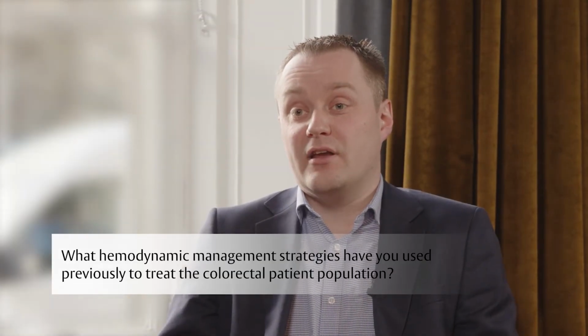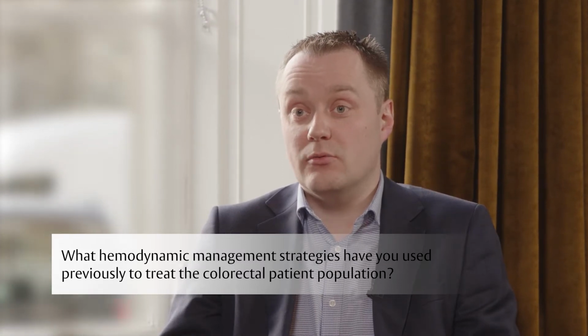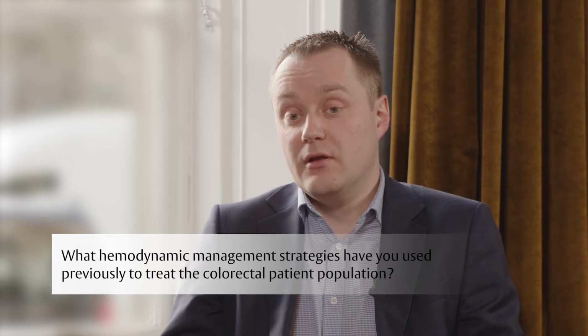So it'll be common practice to deliver anaesthesia for a patient undergoing colorectal anaesthesia and surgery for them to have an arterial cannula in place to have intra-arterial blood pressure monitoring. So we've got really quite invasive and accurate blood pressure measurement going on continuously for these operations, and that would allow you to manage MAP, mean arterial pressure, mainly to avoid hypotension intraoperatively.